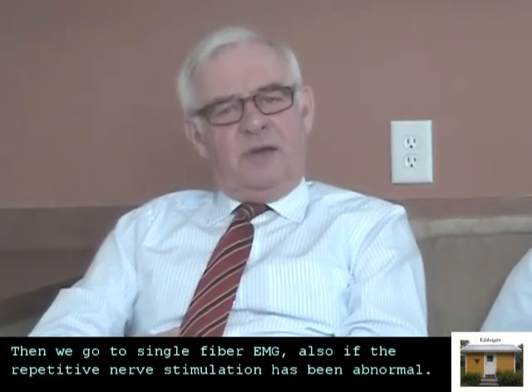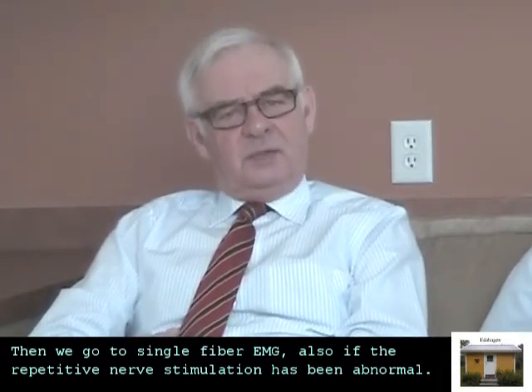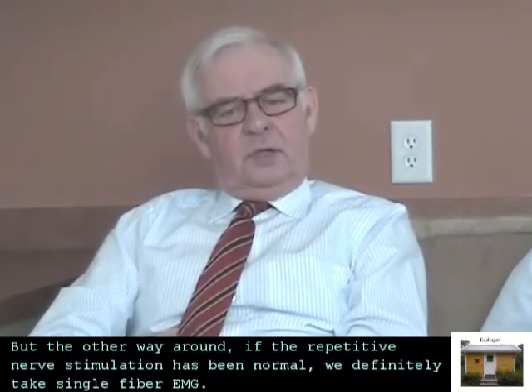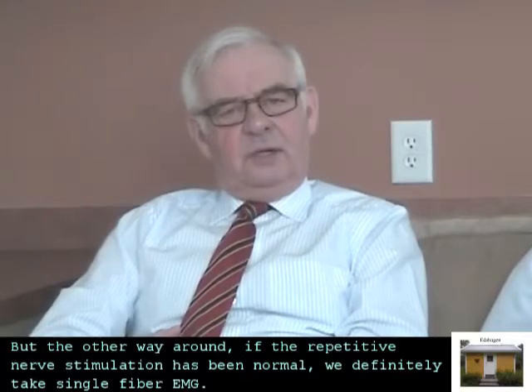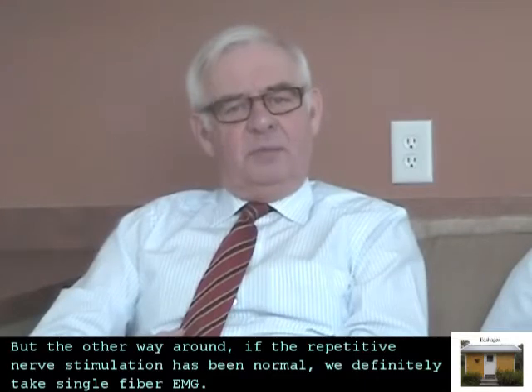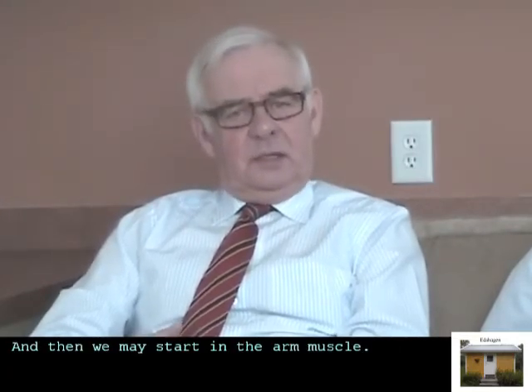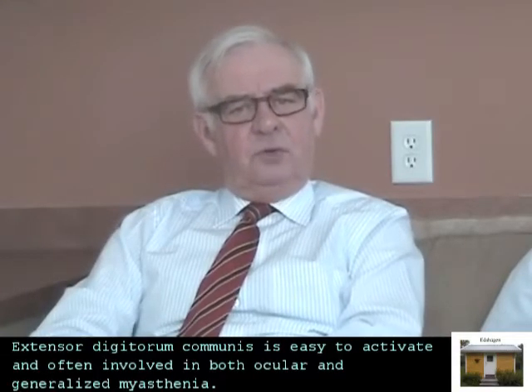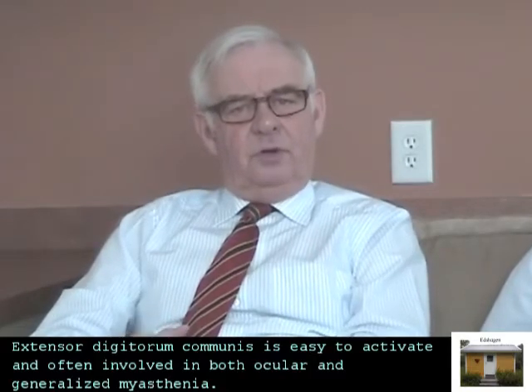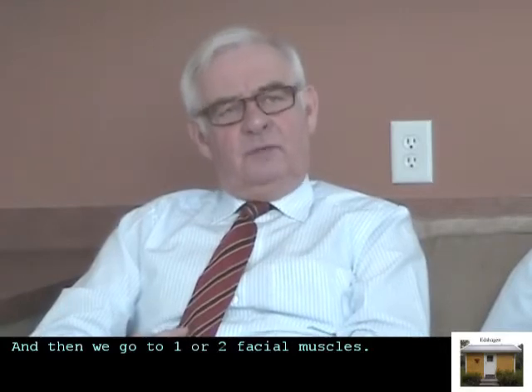Then we go to single fiber EMG. Also, if the repetitive nerve stimulation has been abnormal, but the other way around, if the repetitive nerve stimulation has been normal, we definitely take single fiber EMG. And then we may start in an arm muscle, extensor digitorum communis, easy to activate, and often involved in both ocular and generalized myasthenia. And then we go to one or two facial muscles.